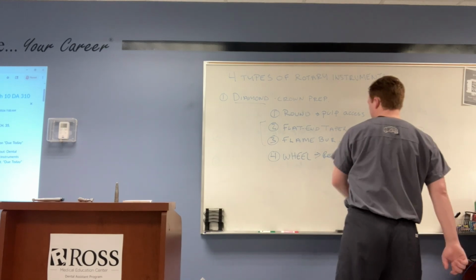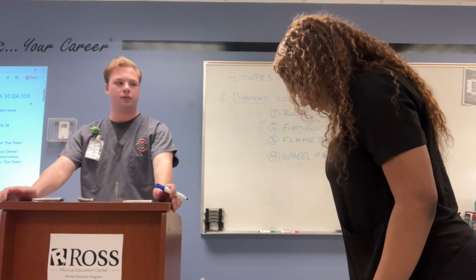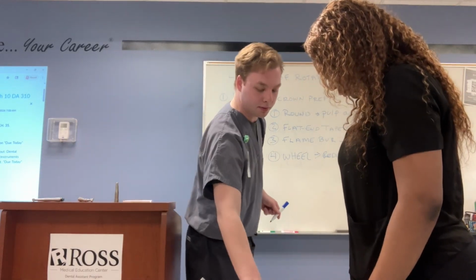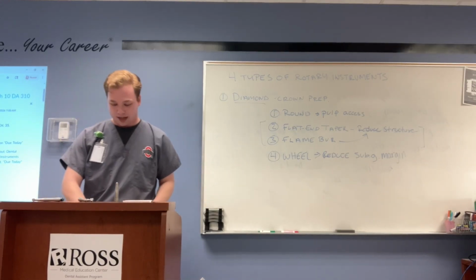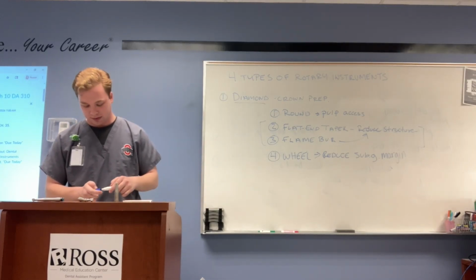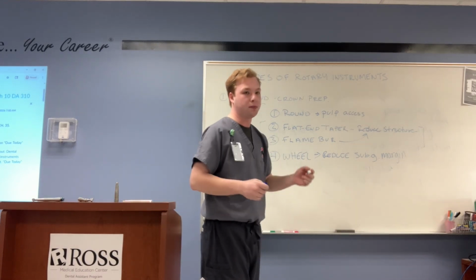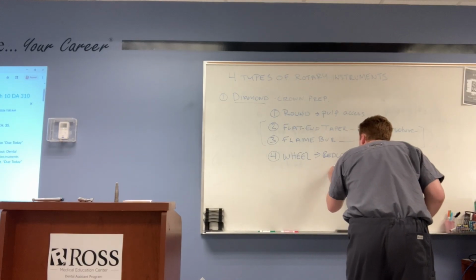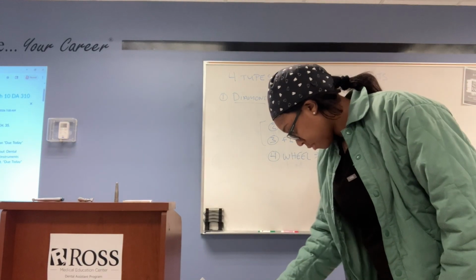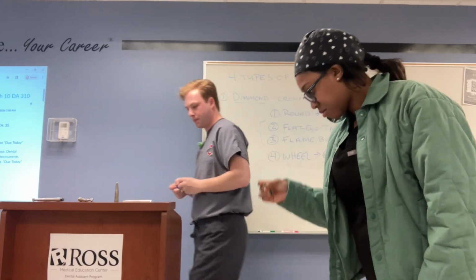All right, the wheel is used to reduce the subgingival margin, okay? If you want to get real specific, you can call them subgingival bevels. Or bevels in that tooth structure, right?